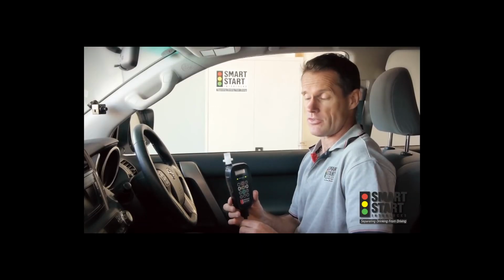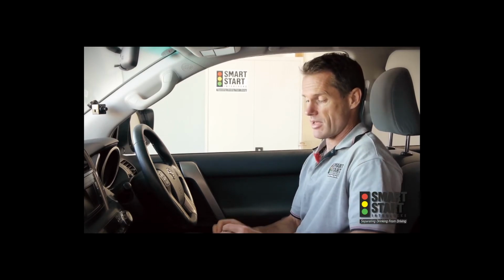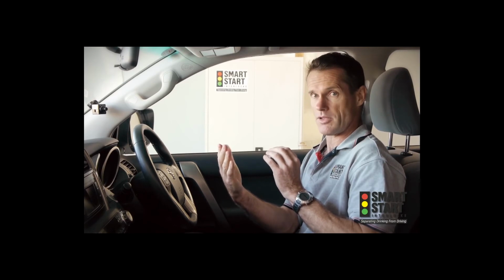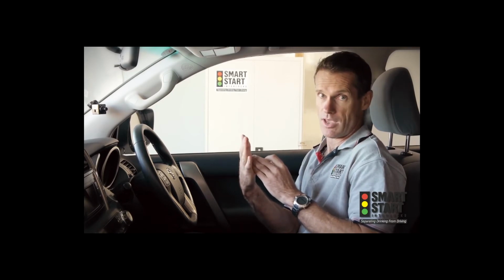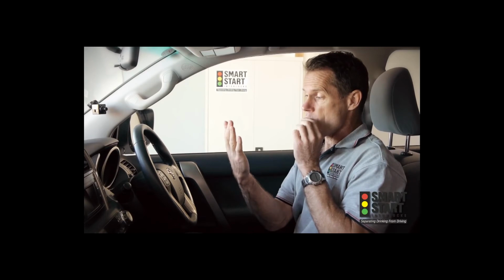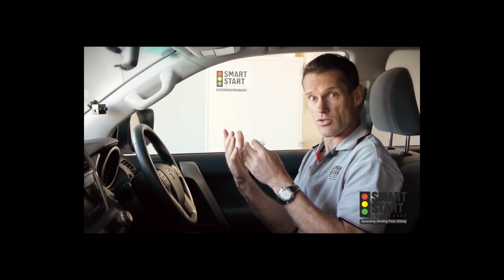As part of the device and learning how to use it, it is easier to remove the mouthpiece and provide a test using the mouthpiece in your mouth with your palm of your hand placed approximately 20 centimeters away from the mouthpiece. When you blow through the mouthpiece, ensure you seal correctly around the mouthpiece and you'll feel the air hit the palm of your hand. If you're not feeling the air hitting the palm of your hand, you're not providing the necessary volume of air that is required. Examples like this. I can easily feel the air hitting my palm. So please do this as part of your training.